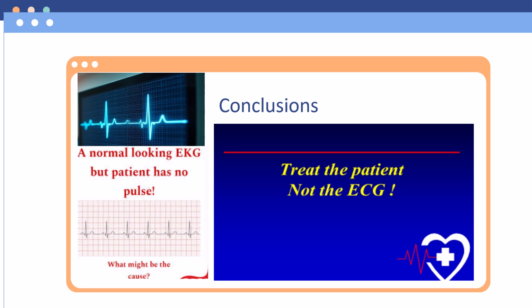So what could that be? I know most of you know it is pulseless electrical activity. So what I want you to understand is the depth of the fact that you treat the patient, not the ECG. But you must know the basics of ECG for you to identify early.